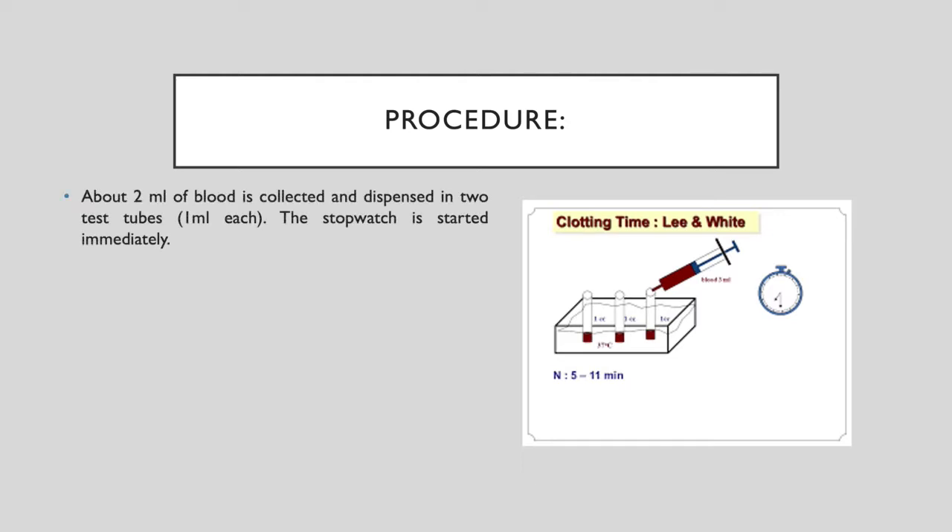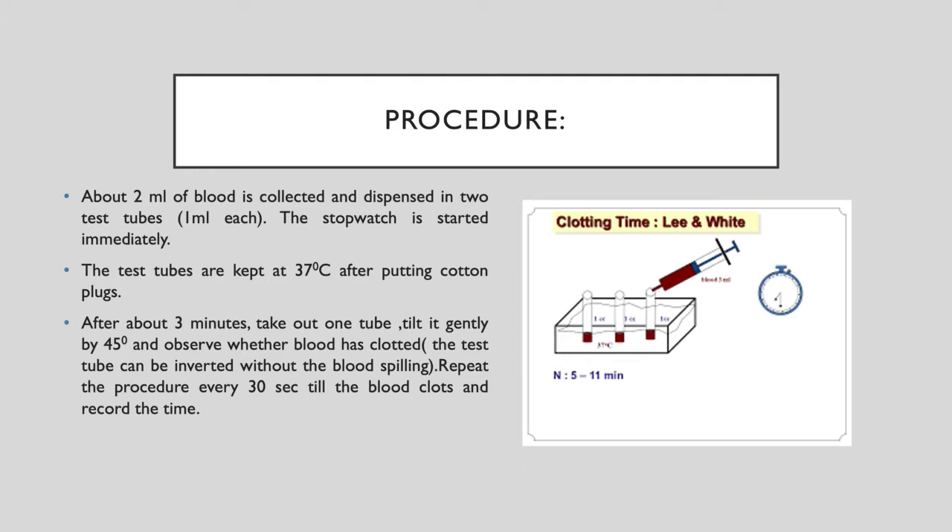Take 2 ml of blood and put 1 ml each into two test tubes, then immediately start the stopwatch. Keep the test tubes in the water bath or dry bath at 37 degrees centigrade, and plug the test tube mouths with cotton.